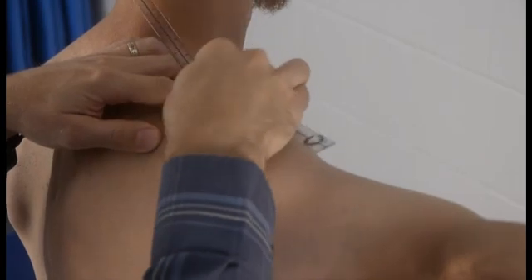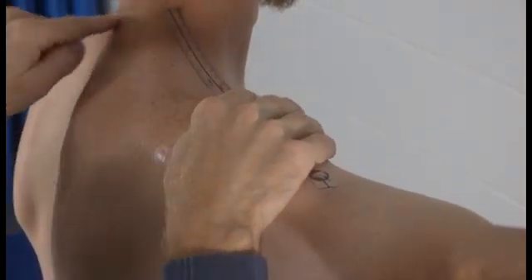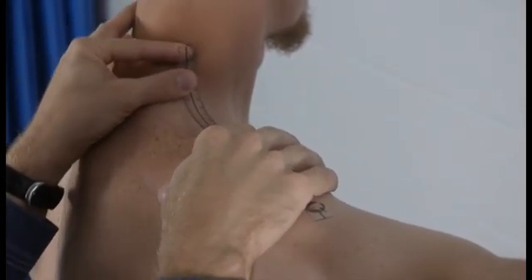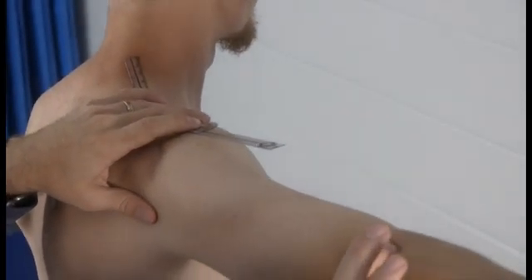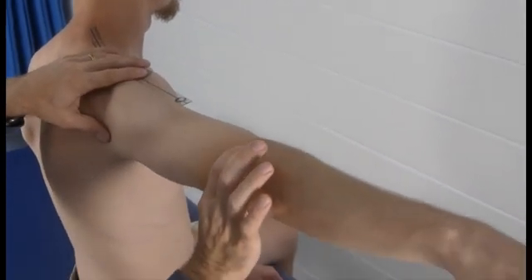The stationary arm is placed over the shoulder in line with the cervical spine, and sometimes you have to bend the end up a little bit to avoid poking your patient in the neck. The moving arm is lined up with the lateral epicondyle right here. That's the starting position.